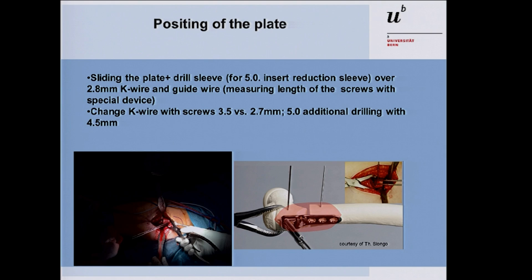The proximal fragment should be fixed with a bone clamp — the spania clamp included in the tray — for safe and secure mobilization of this fragment. Then prepare the plate as shown in the workshop: put the drill sleeves on the plate and slide the plate with drill sleeves over the 2.8 K-wires. If the osteotomy is perpendicular, the plate should contact the bone directly; otherwise, resect a small edge for direct bone contact. Use the special measuring device for screw length. Pre-drill the 2.8 mm K-wires approximately 5 mm below the growth plate of the femoral epiphysis.